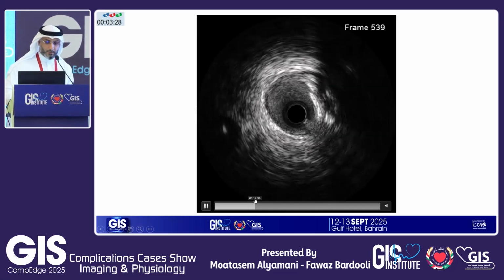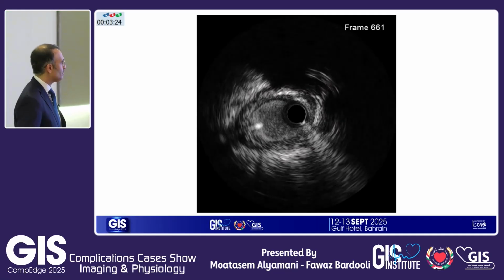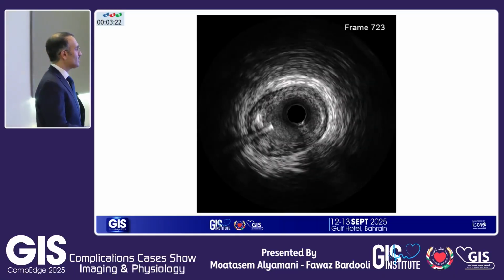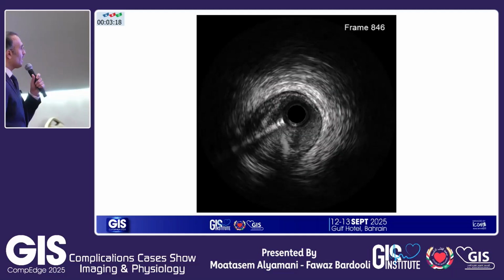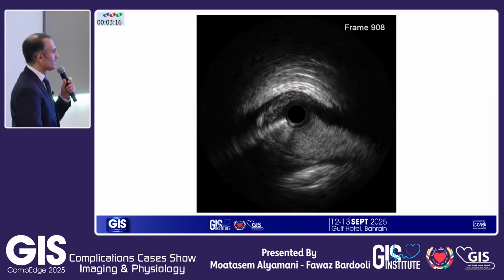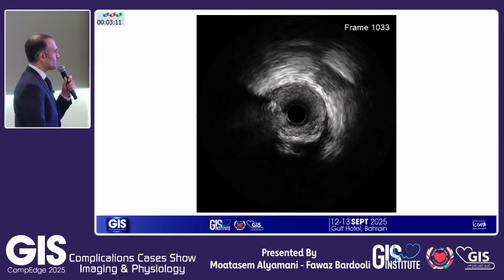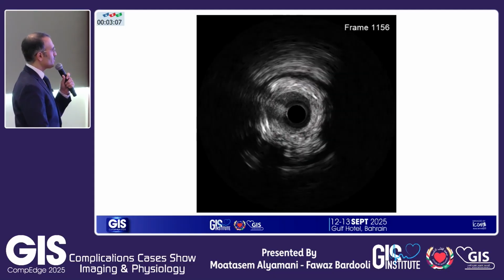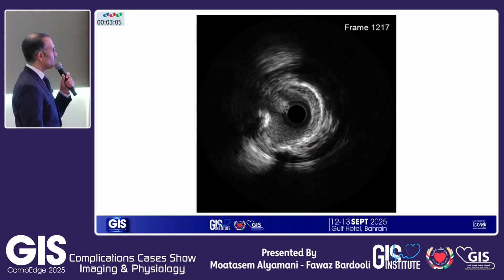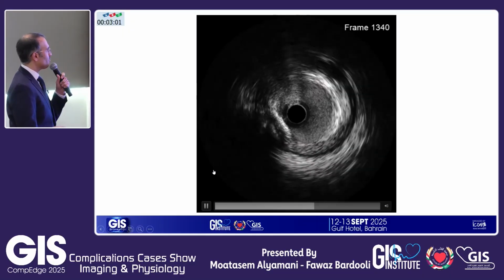So you saw the bifurcation. There is no doubt here that you have a plaque, and the plaque burden increases at the bifurcation level here. You can see that eccentricity of the plaque, and you start having more plaque coming in. Now there is a branch in the proximal LAD, and now gradually you will see the proximal LAD, and then you will start having the wire coming, I think, from the circumflex.